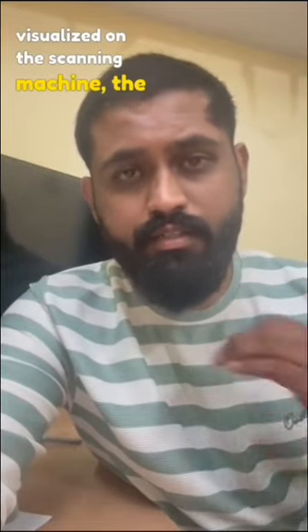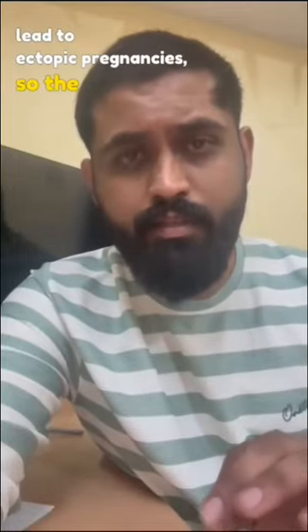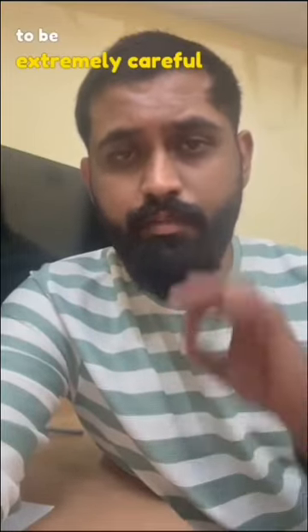Now, once the tip of the catheter is visualized on the scanning machine, the embryologist starts to push the media at a very slow pace. Pushing the embryos like it's a pichkari might lead to ectopic pregnancies, so the embryologist needs to be extremely careful when he's pushing the embryos.